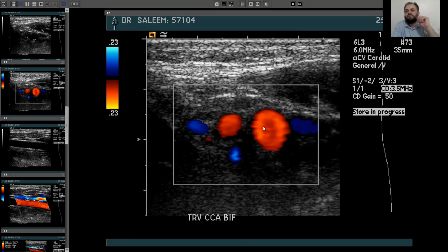And it is posteriorly lateral, or lateral posterior. That's another point. The fourth differential: the ICA is a low resistance flow. It feeds the organ, so we see a lot of blood flow in diastole also. They don't touch the baseline. And the ECA is completely the opposite. The diameter is smaller. It is a high resistance flow. It can be biphasic flow. It touches the baseline too. And at the end of diastole, we see no flow or only a little bit of flow.